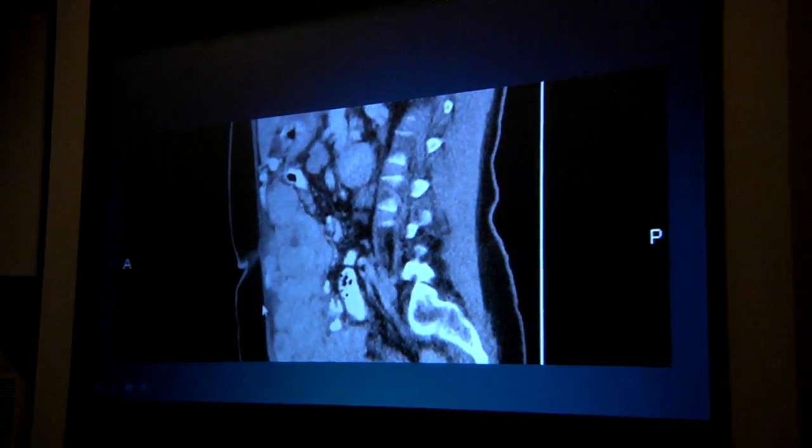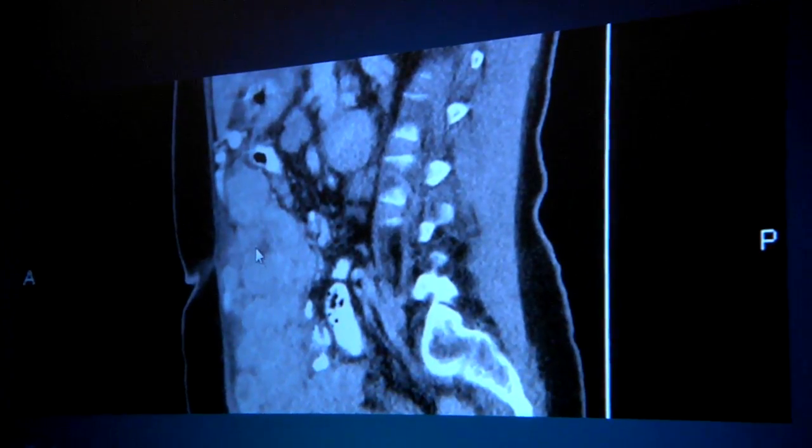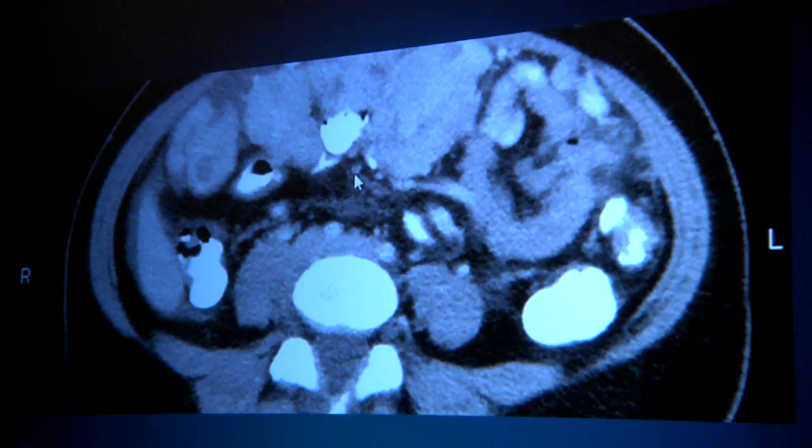This is a patient with bulk disease that we can see on the sagittal CT. This is the so-called omental cake. This was metastatic colon cancer. There are bits of ascites in here. This is the tip of the right lobe of the liver. Here is some more of the omental fat that is infiltrated. You can see the peritoneum here in the left pericolic gutter. This is not a challenge.